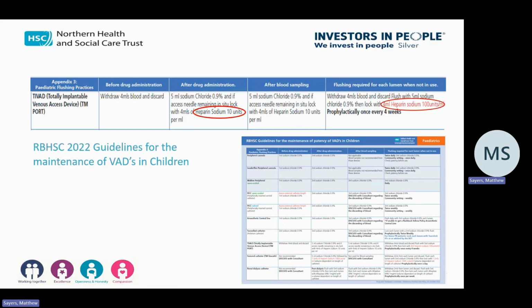Lisa's demonstrating that lovely turbulent push pause. And then locking. You could be giving a medication and then flushing. Whatever you're giving, use that same pulsatile technique.